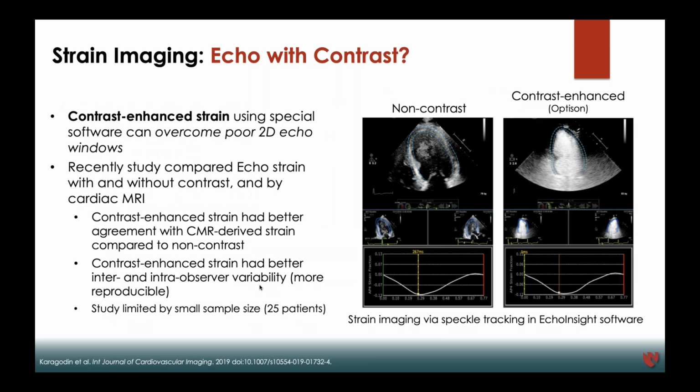And this kind of goes back to echo, but contrast enhanced strain is something that's coming up as well. Echo Insight is the only software that I'm aware of right now that is able to look for contrast enhanced strain. This was a study done by Dr. Lang's group, who I trained with in fellowship.